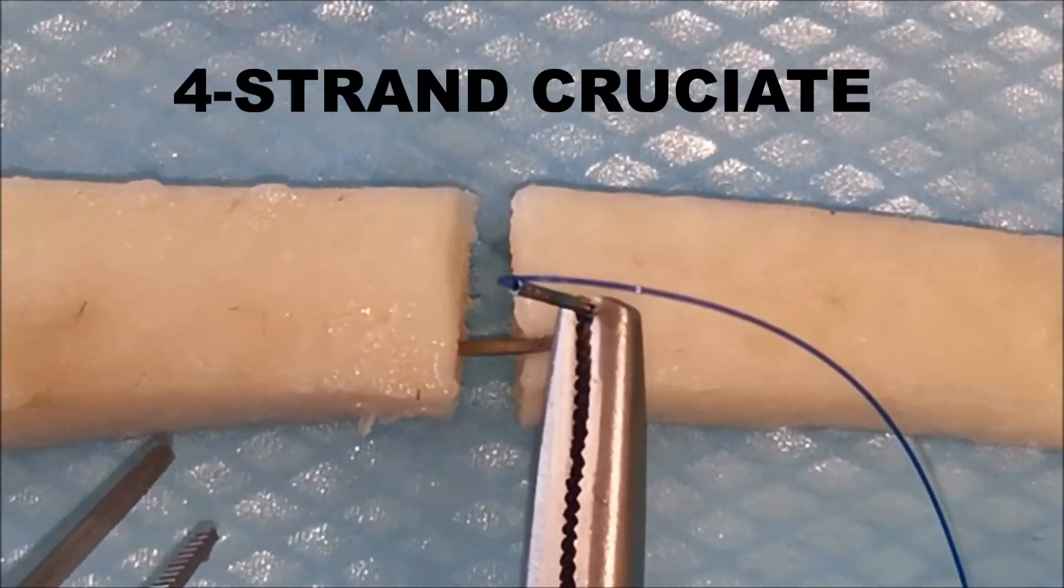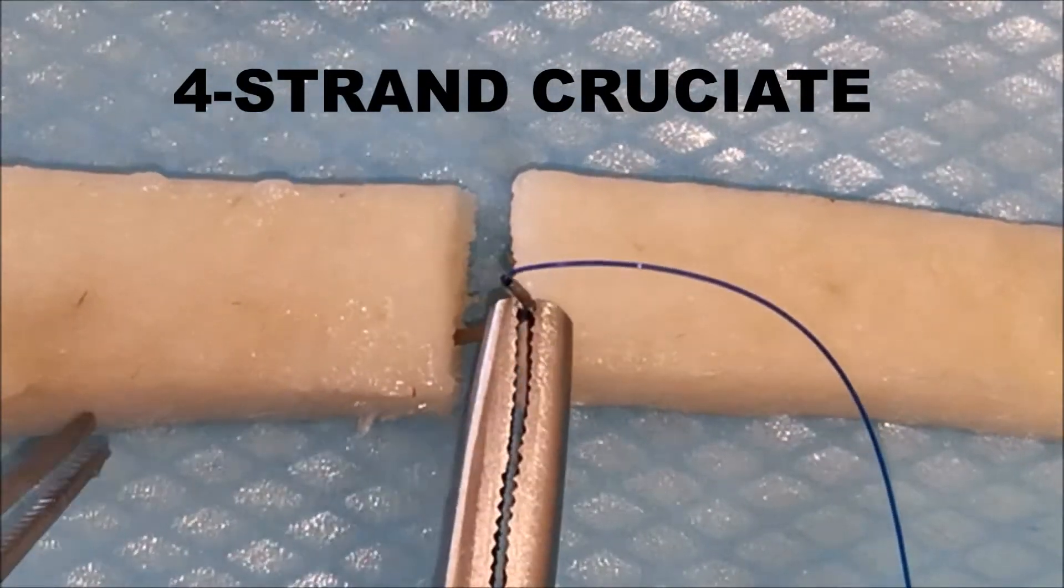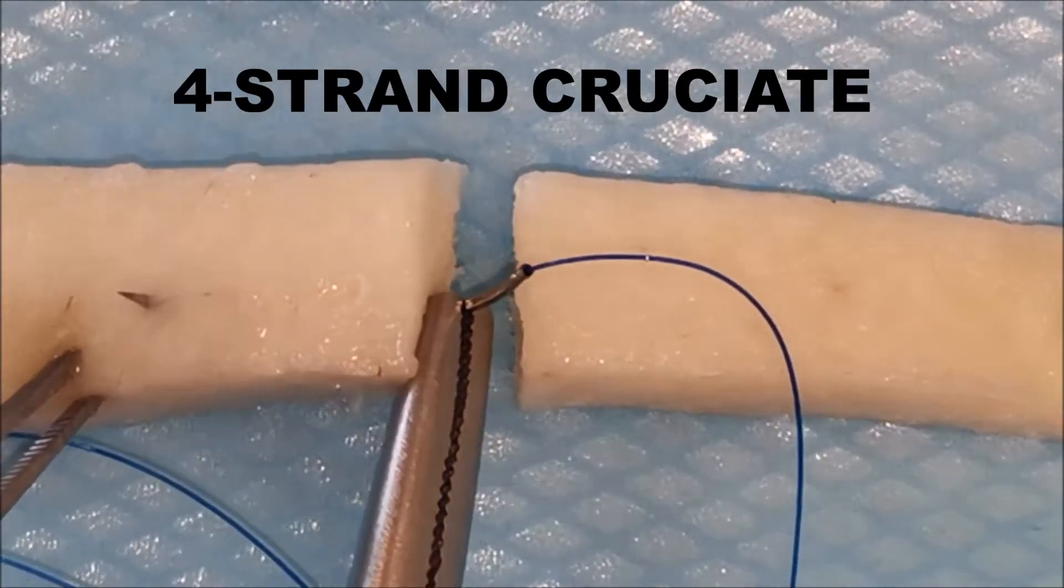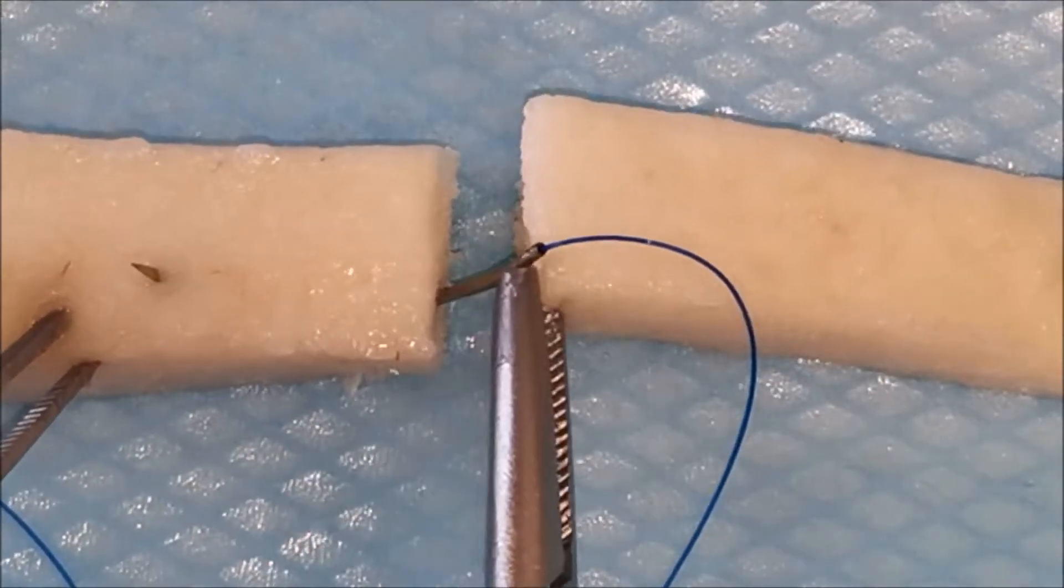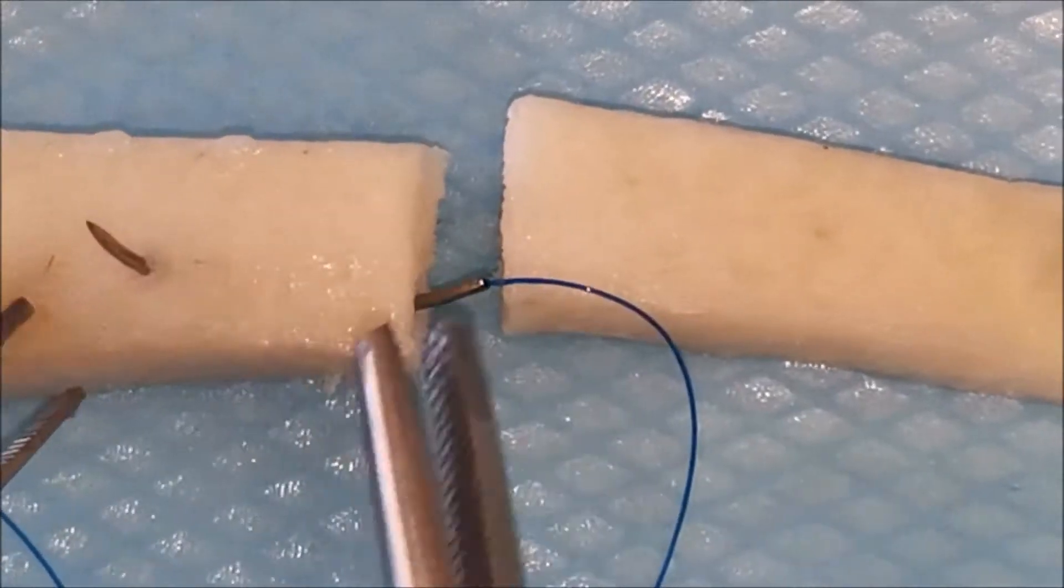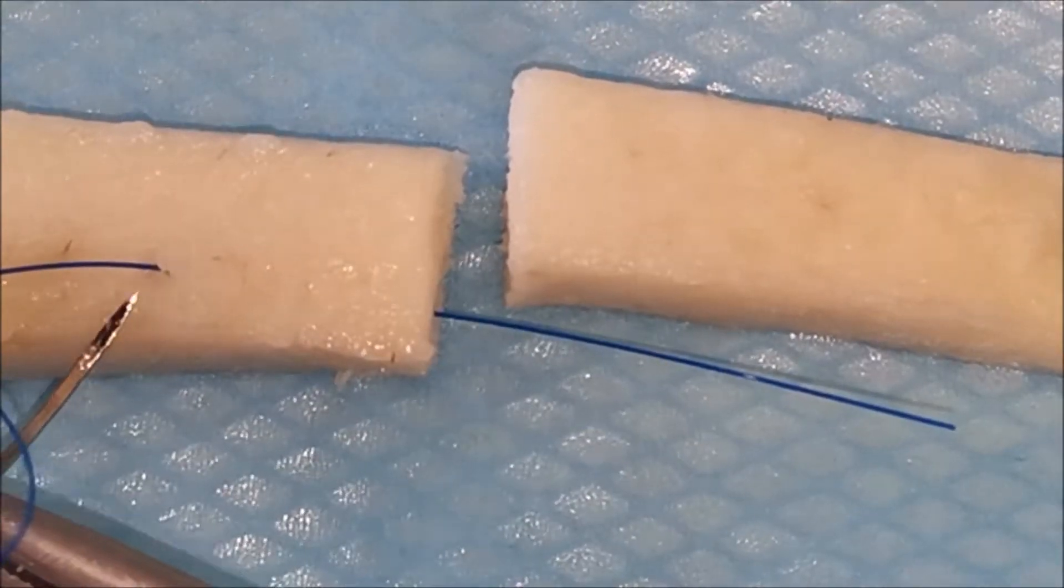We'll do the four strand cruciate once again on a tendon. The first bite is taken and you want to ensure you take at least a centimeter if possible.